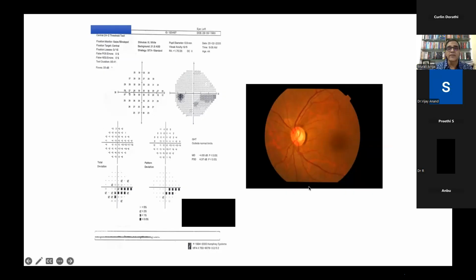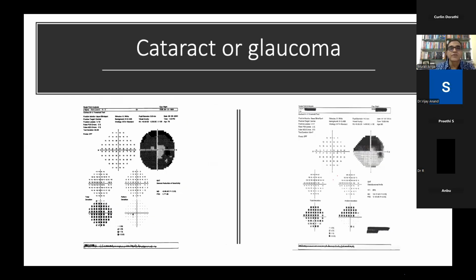This has to correlate. Suppose you accidentally miss this kind of scotoma, the RNFL defect, you see it on the field, you suspect something, pressure is 26 and you've done a visual field and you pick it up like this, go back and see it on the disc, which is why we said disc documentation is important. Document disc photographs, do a visual field, look at the change on the disc and structural change over time, and keep monitoring for change in the visual field.